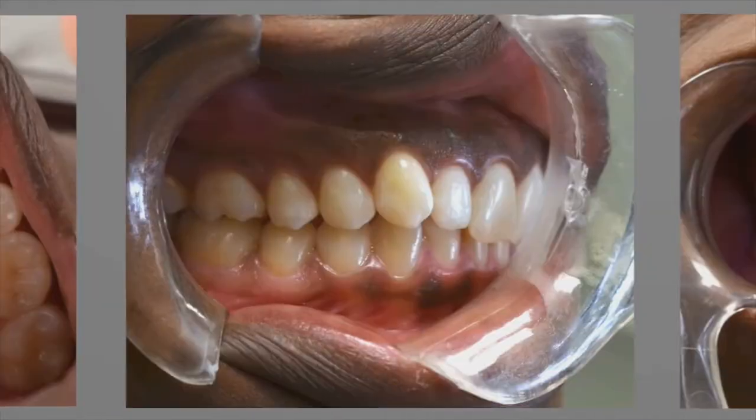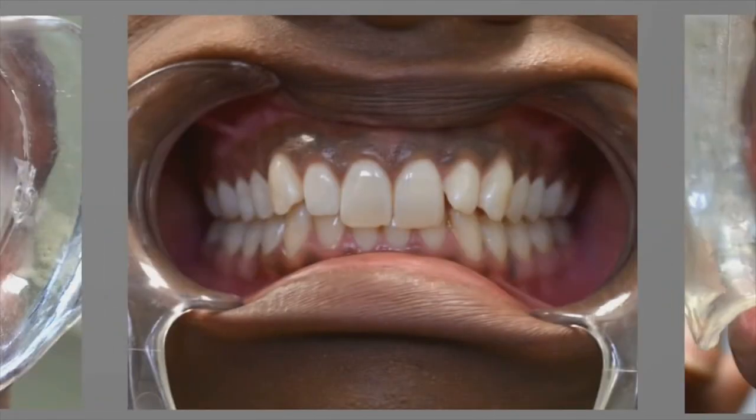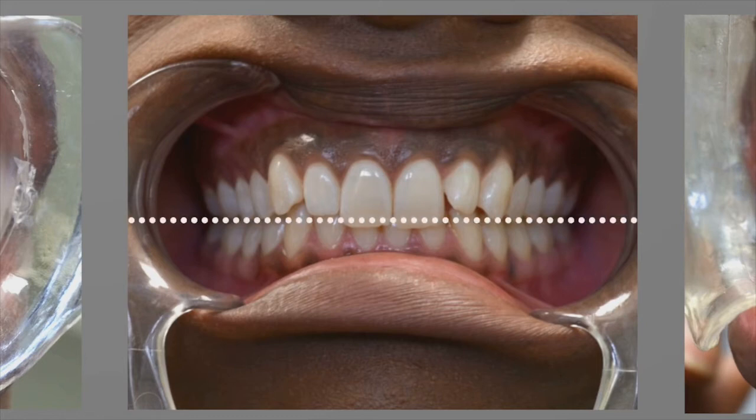The left and right lateral photos should include all the teeth and attached gingiva between the first molars and both central incisors. The occlusal plane should be parallel to the frame, and teeth on the far side of the arch should not be visible. The frontal intraoral photo should feature an equal display of posterior dentition, with the teeth in occlusion. The occlusal plane should be horizontal, bisecting the photograph. Show the attached gingiva. Use cheek retractors to ensure all the necessary elements are visible.